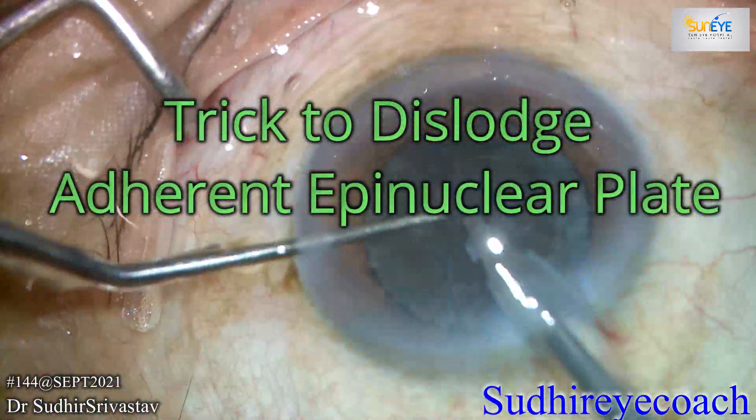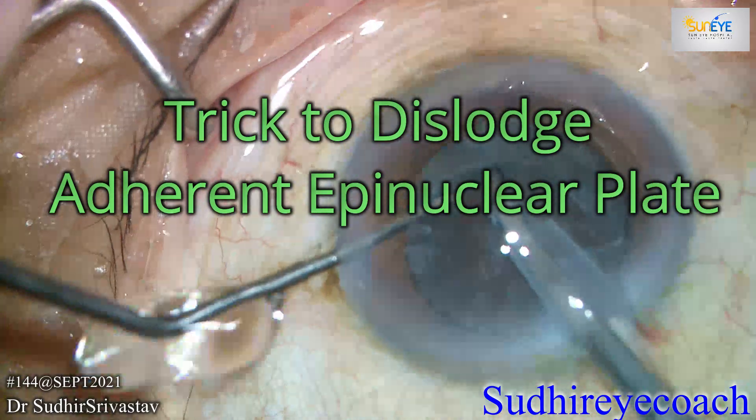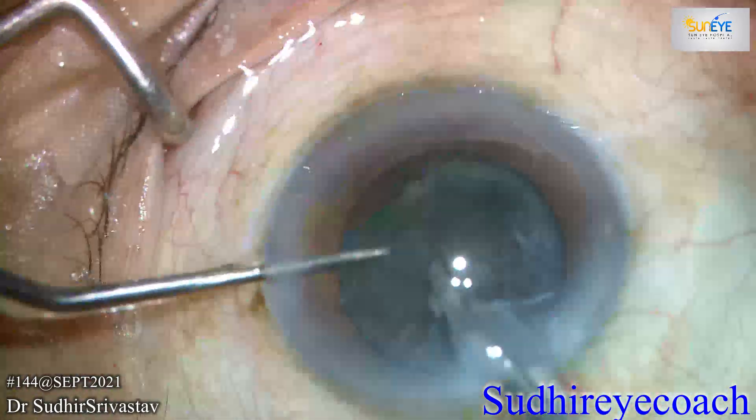Hello everyone. As you all know, in FACO every step is important, and epinuclear plate removal is one of the trickiest parts in FACO surgery.